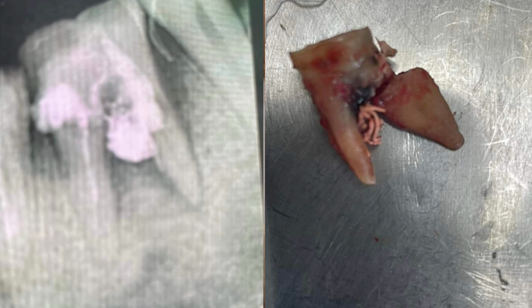So another few complications that we would like to share. I will be putting up the X-rays. In these, you will see that the anatomy is somewhere and the filling has been done somewhere else. So I would not say this is a complication.